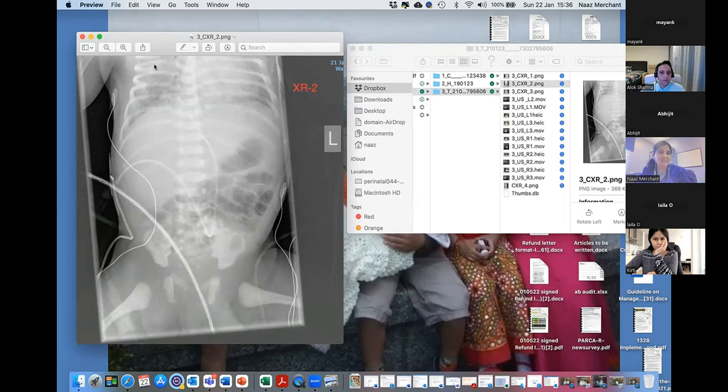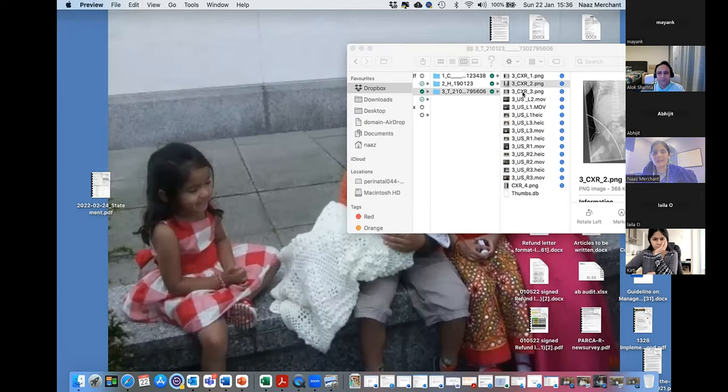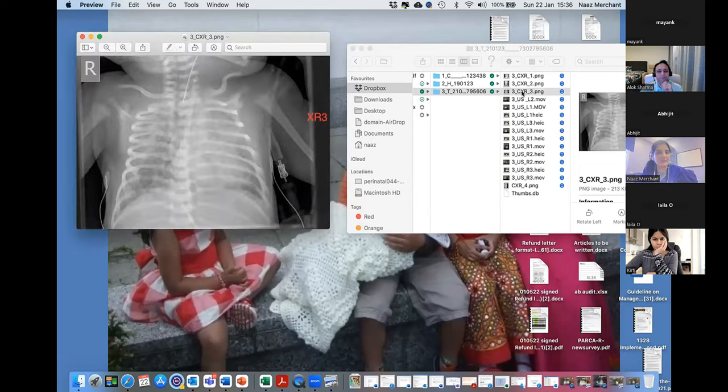This X-ray doesn't show much of the lungs, and I have another X-ray, but as you can see, it's got a lot of patchy white infiltrates. It was mainly done for the UVC, which we were putting in at that point. But I have another X-ray, which you can see where the baby's been intubated. This was around 4 hours of age, and you can see the heart margin is pretty much not visible as such. There are just multiple patchy infiltrates in this baby.